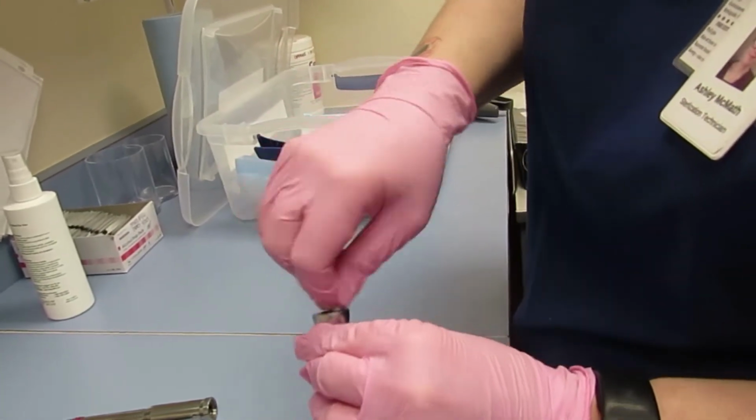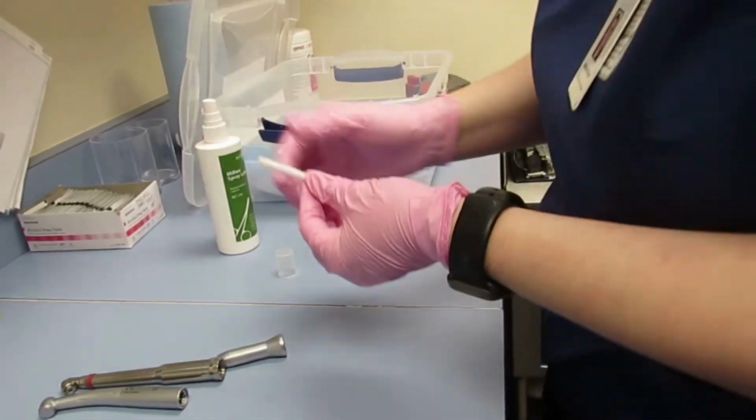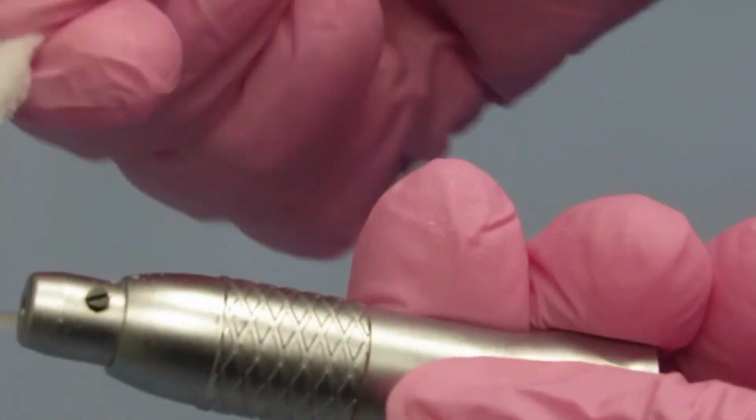This is a Profi, a low-speed handpiece. It has a small screw which tends to rust. You can either spray the screw with a water-based lubricant or apply the lubricant onto a pipe cleaner to remove the rust. This type of lubricant also works as a rust inhibitor.